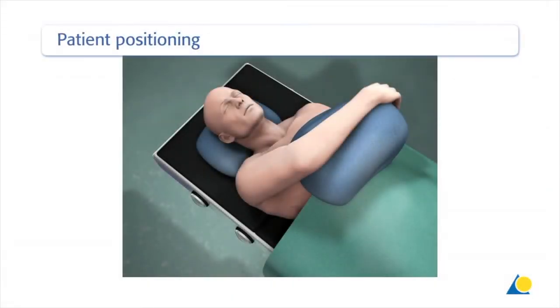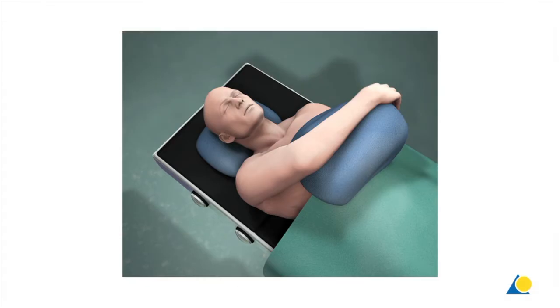The patient is positioned supine on the radiolucent table. The extremity is prepared from the axilla to the hand. This preparation allows rotation of the forearm as well as flexion and extension of the elbow during the operative fixation.